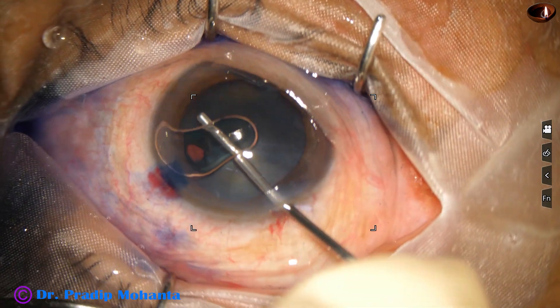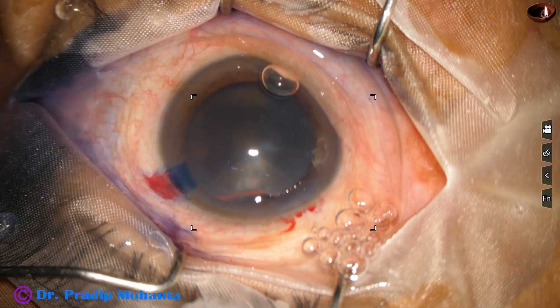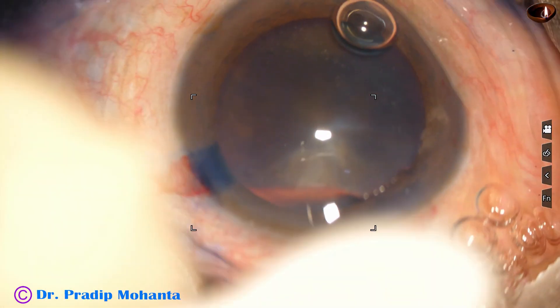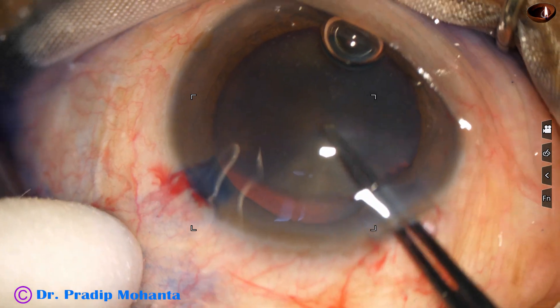The anterior chamber is now filled up with 2% hydroxypropylmethylcellulose. The microscope is OMS 90 from Topcon — no financial interest.